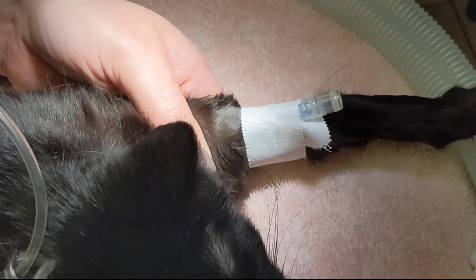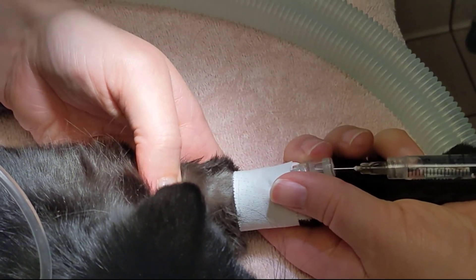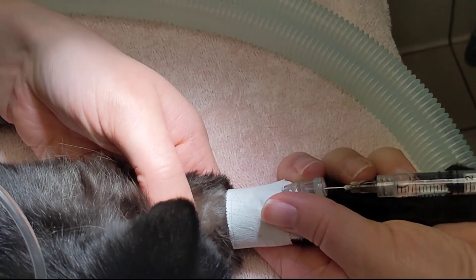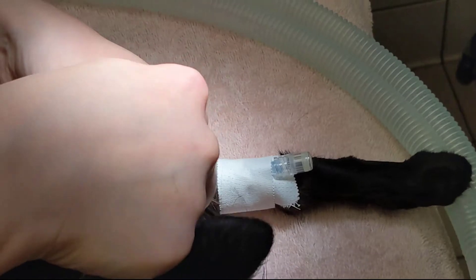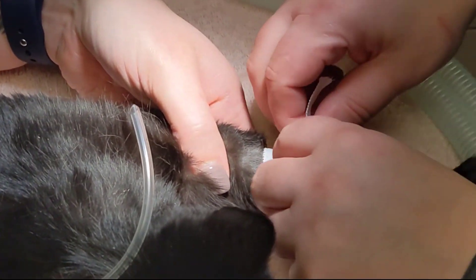In this case, IV flush was inserted into the vein to test for a successful catheter placement. The technician holding the vein did feel flush moving into the vein, so the catheter was successfully placed and was not damaged during placement.